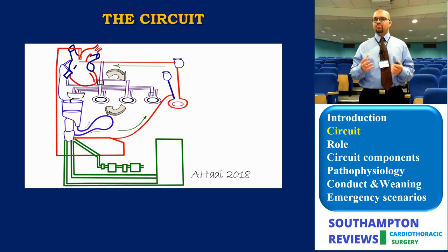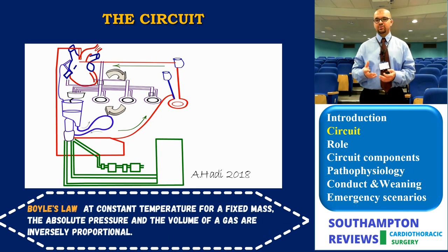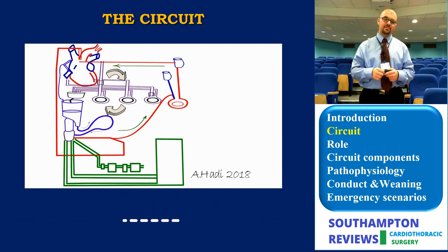Why is that? Simply because if you warm blood saturated with oxygen, you are more likely to create micro bubbles and extract oxygen bubbles out, gas out of the blood and create microemboli. Hence, the heat exchanger is always upstream. You heat desaturated blood, not saturated blood.